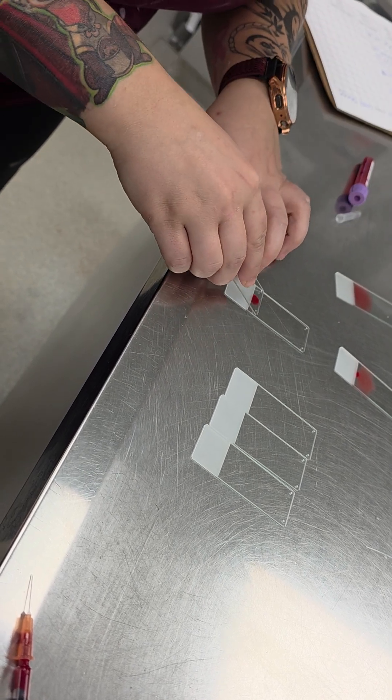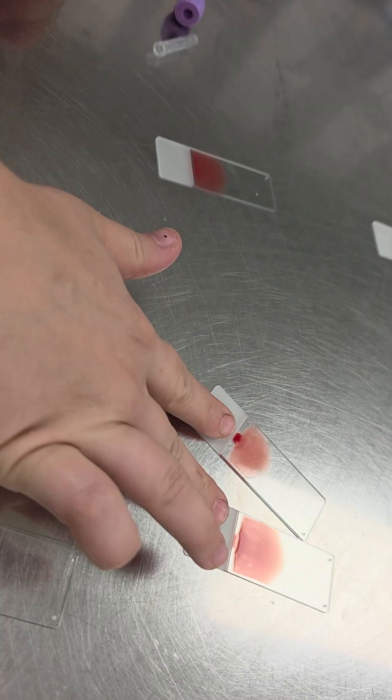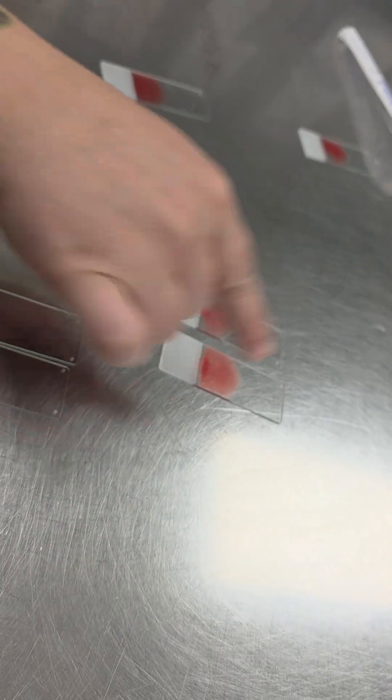We're not going to use that one. So this one and this one are the better feathered edge — that's what you want, is that curve.